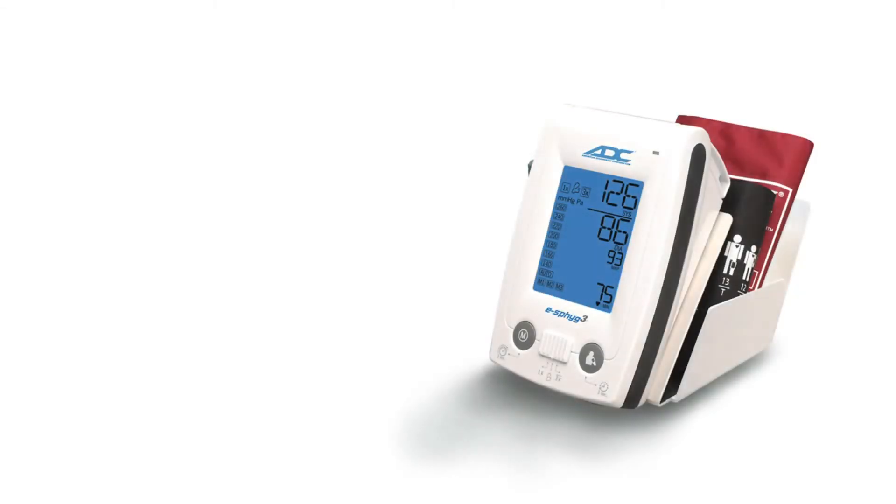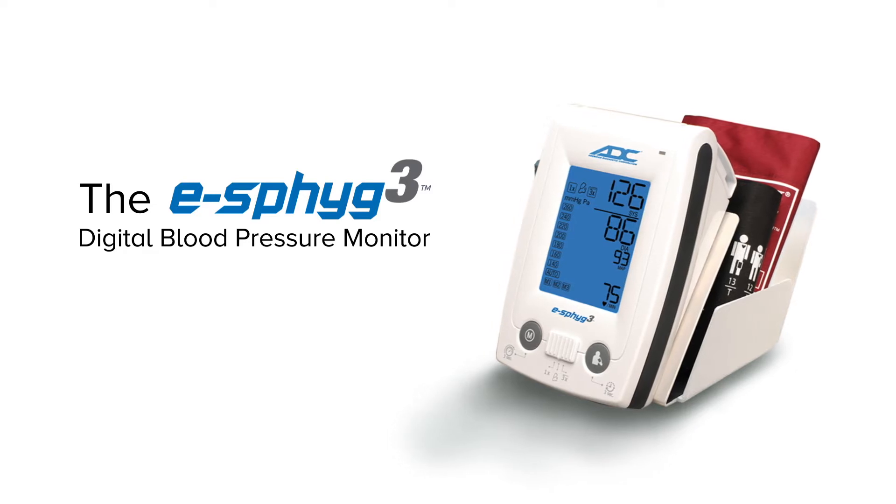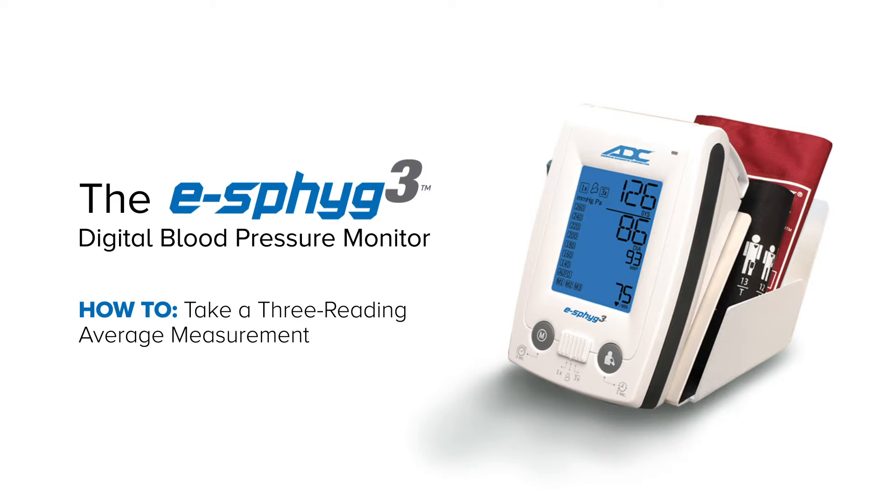ADC's all-new eSIG3 is a feature-packed, professional-grade NIBP monitor with three clinically validated modes, including Single Measurement Mode, Customizable Average Mode, and Manual Mode. In this video, we'll show you how to take a three-reading average measurement.